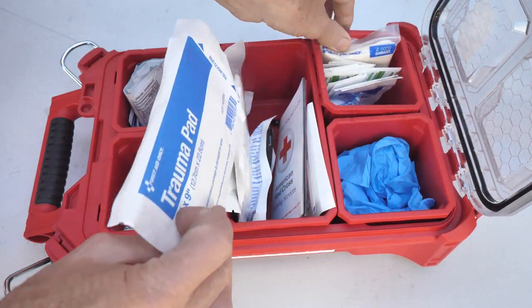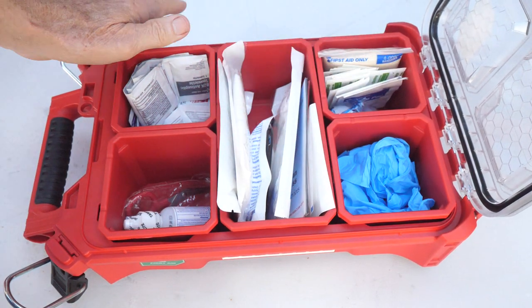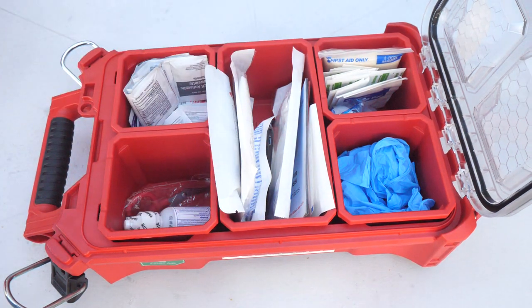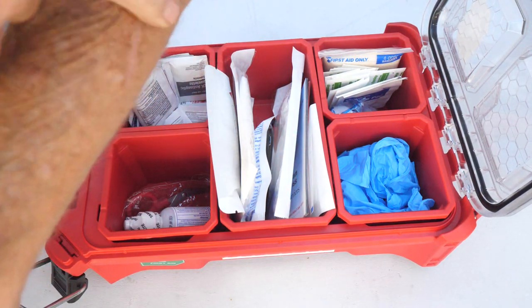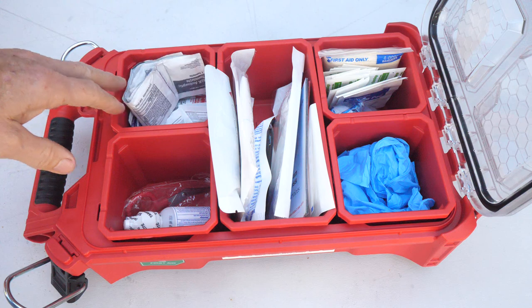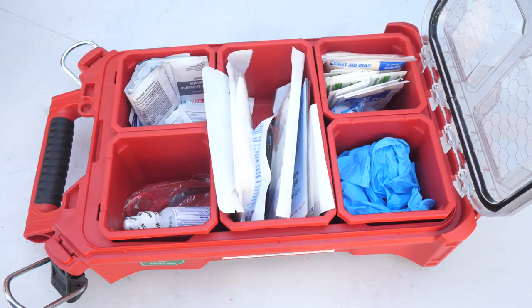You've got blue gloves — it's a really nice kit. You can add things to it too; there's more room in here. As soon as I'm done making this video, this is going in my van right away. I got cut not too long ago — about a four-inch cut on this arm — and I pulled out my first aid kit and it was missing so much stuff that I didn't really do anything until I got home. So believe me, this is going right in my van.